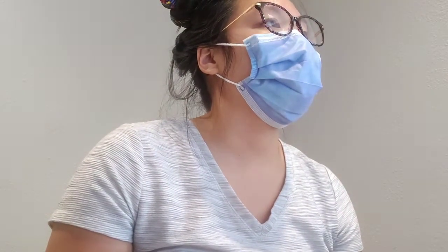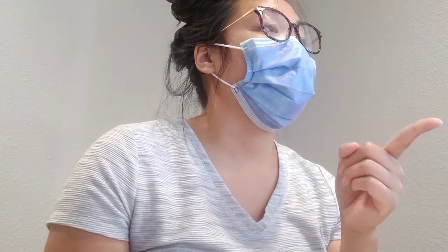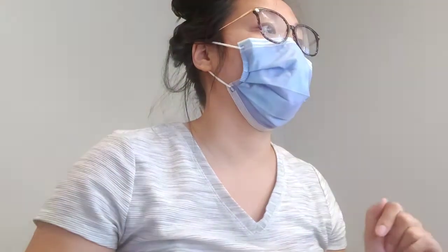Next question. For a routine thoracic lumbar CT of the adult patient, the recommended scan field of view is, the answer is 50 centimeters. And the recommended display field of view is 12 to 20. I got that wrong. When performing a routine CT chest, the scanner should be zeroed with the laser light at the top of the shoulders. So start up here, zero it out at the top of the shoulders.